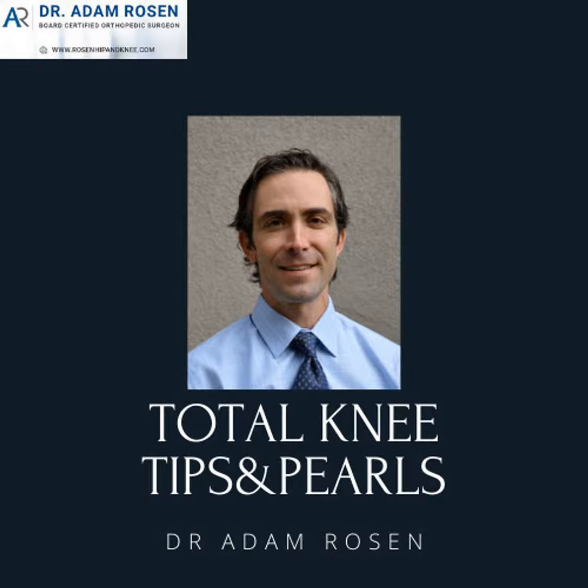Other options you need to be aware of: do you need to do a quad snip? Do you need to do a turn down? These are all things to keep in your bag of tricks, so that if you get in there and things are really tight, you know what you may have to do to prevent an injury. Obviously, we don't want to do it if we don't have to, but I use the analogy that it's quite similar to an ETO in a hip revision.